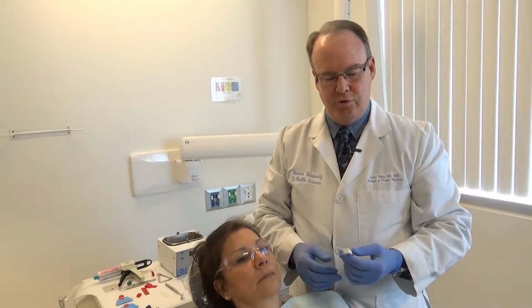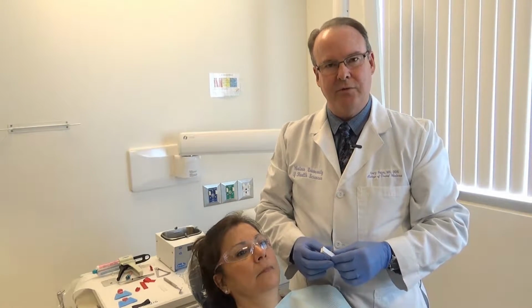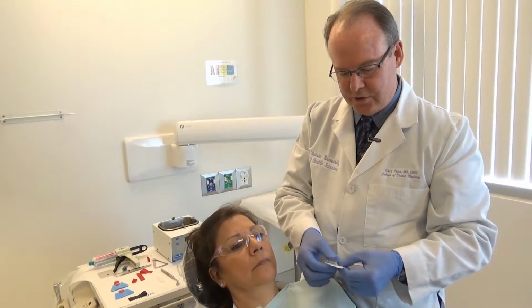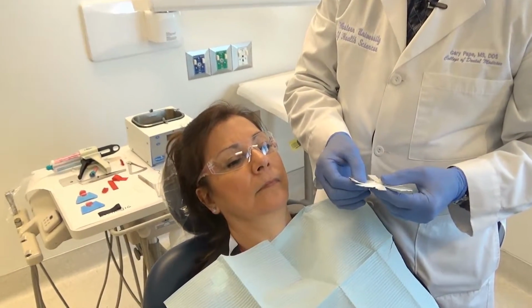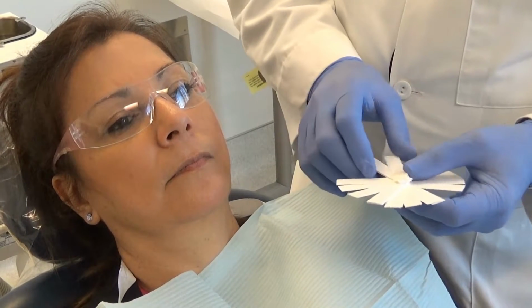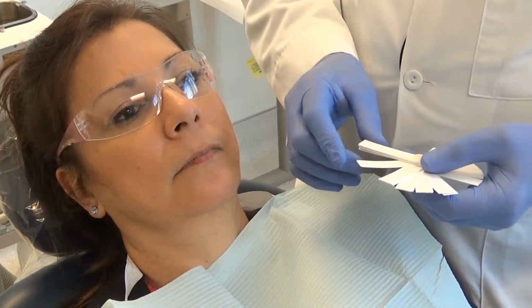Okay, next we're going to take a centric relation record using a leaf gauge and AccuFlow. So just a leaf gauge and just some AccuFlow. All right, so this is a leaf gauge. If you fan it open, you'll see that there's a number of leaves on this gauge. The leaves are 1/10 of a millimeter thick. That would be 0.1 millimeters thick per leaf. So 10 of these together would equal 1 millimeter, and 15 of them would equal 1.5 millimeters.